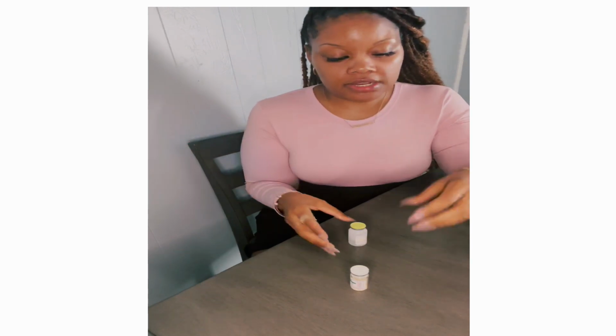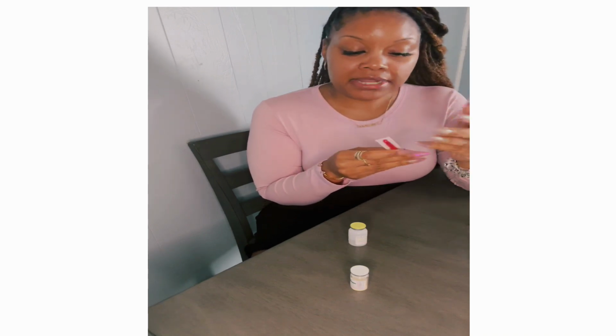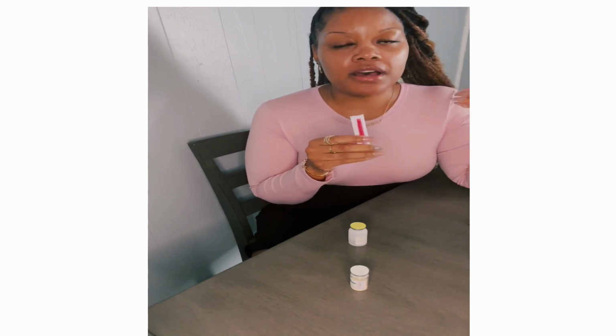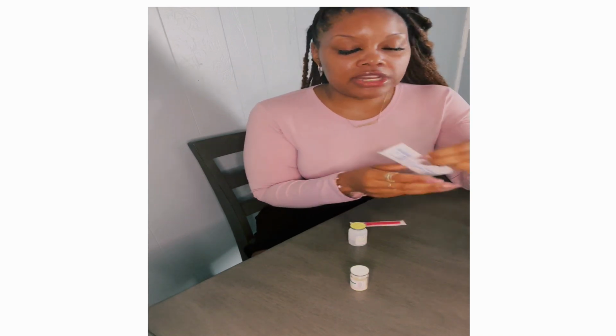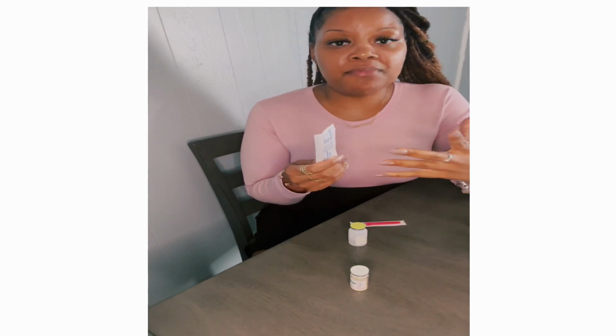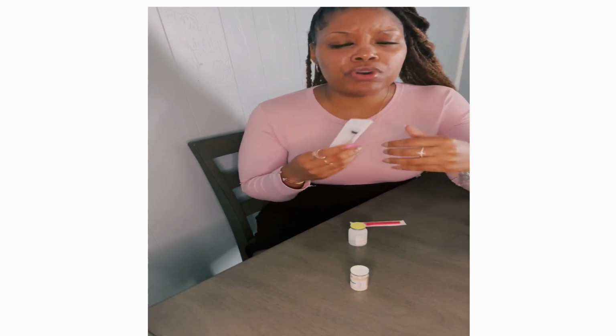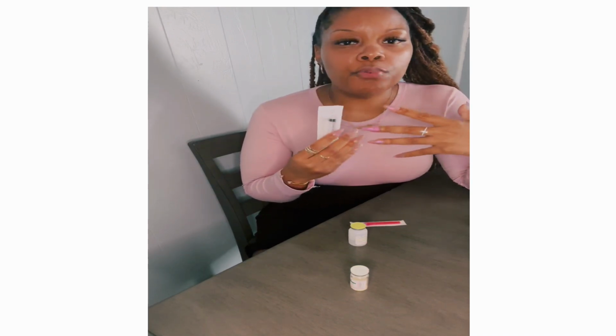What else are you going to need? You're going to need a needle. So what I'm using is a blunt tip needle. But if you have needleless needles, then you can use those. And then you're going to need a syringe. So when it comes to how big your syringe is, we already worked the math problem out. So we know that we need to administer 1.5 mLs. So I have a 3 ml syringe. So let's say that I had to administer 0.5 mLs. I wouldn't get a 10 ml syringe.